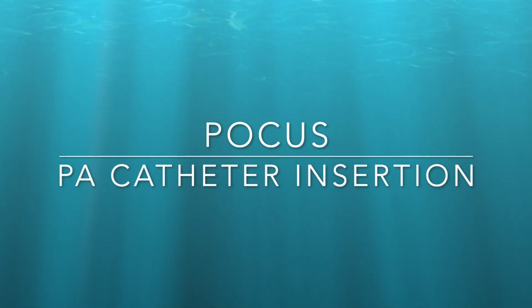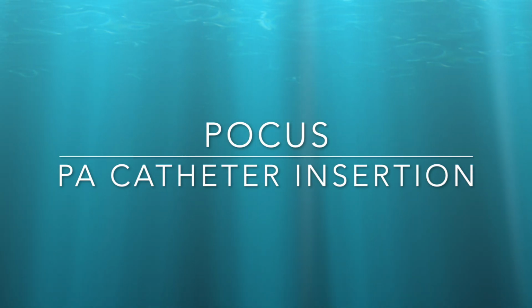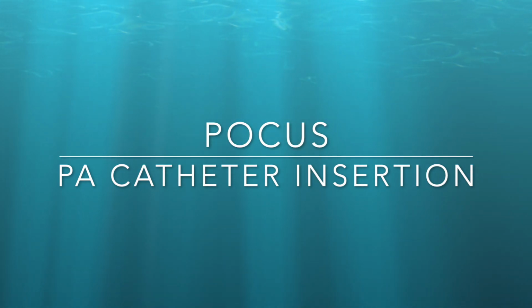In this video, I am going to demonstrate how to insert the pulmonary artery catheter or Swan-Ganz catheter.